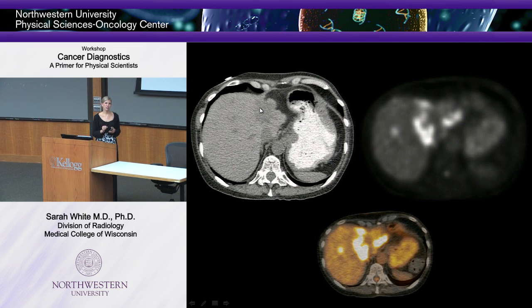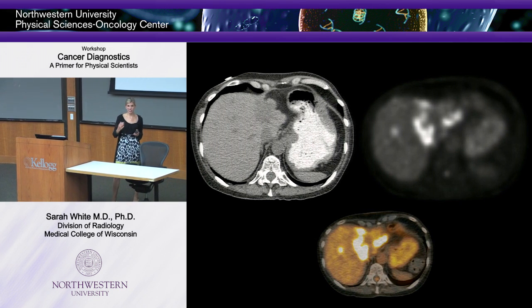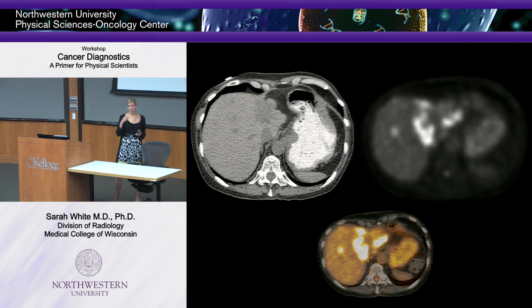It just looks different than the rest. Now I can't tell you what it is. I just know it looks weird. I can't give you contrast to see if it's hypervascular, hypovascular, if it enhances different. Is it scar? What is it? I can't tell you that without contrast. But I can tell you it looks weird, okay?